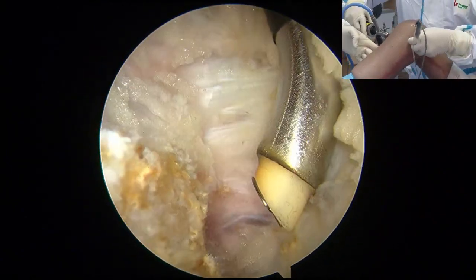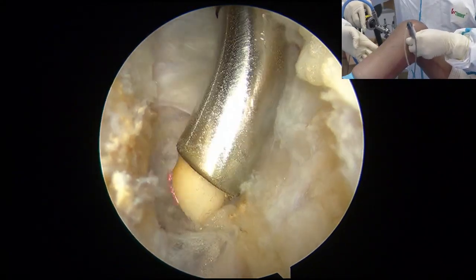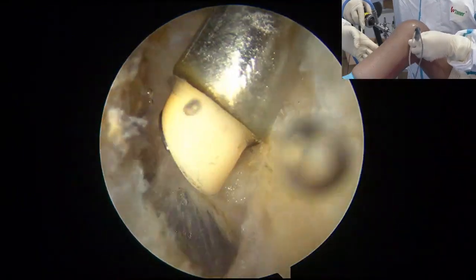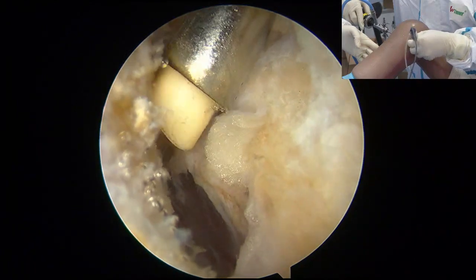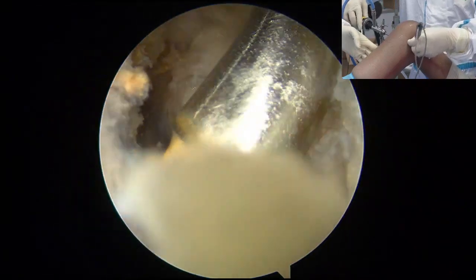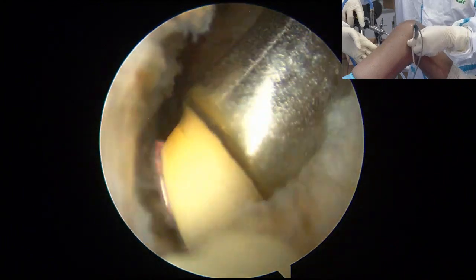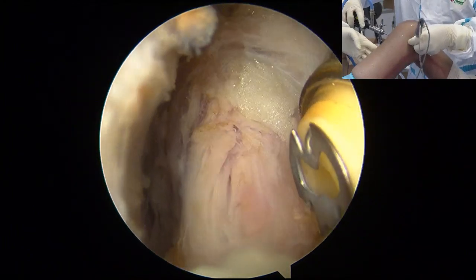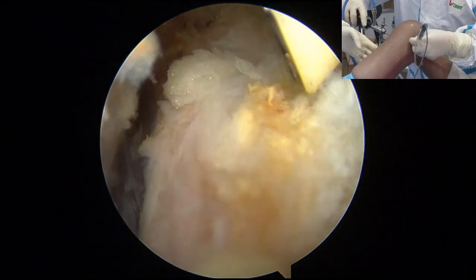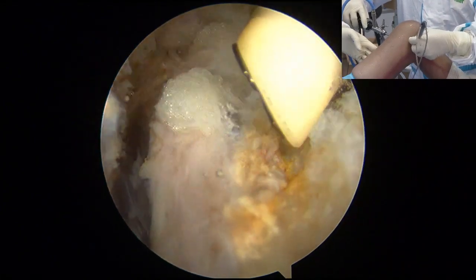Okay, stop. Now you can see the muscles there. That is the popliteus muscle. 那现在看到的就是腘肌的肌肉部。You can see the fresh fibers here. Now we get out of the capsule. You see, that is the end of the capsule, right? 好，那是关节囊的终点了。That's the end of the capsule, and then you start to see the muscles coming. That is the muscle of popliteus. You see that? 这一部分就是肌肉，是来自腘肌的。Yeah, so our landmark for the PCL insertion is you identify these popliteus muscles.